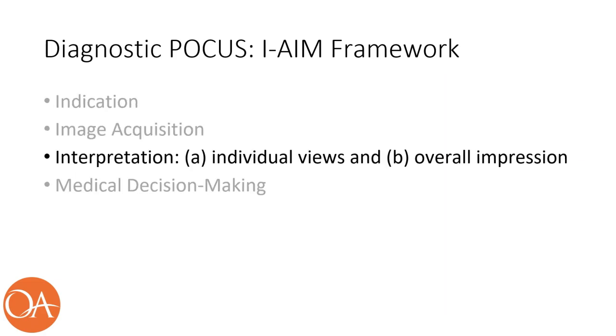For this examination, each view will first be evaluated independently, then integrated to form a cohesive overall impression. Let's begin by examining the individual views.